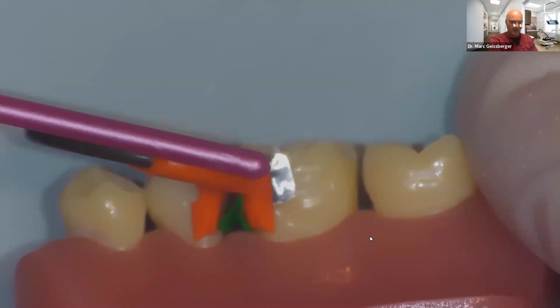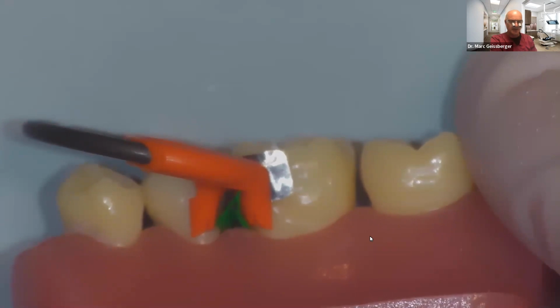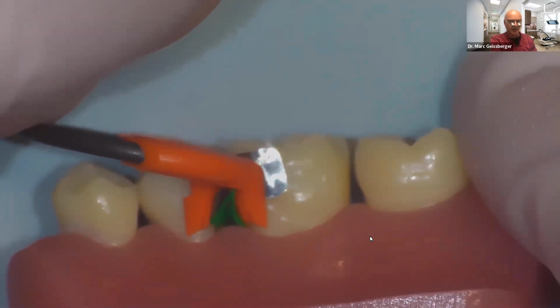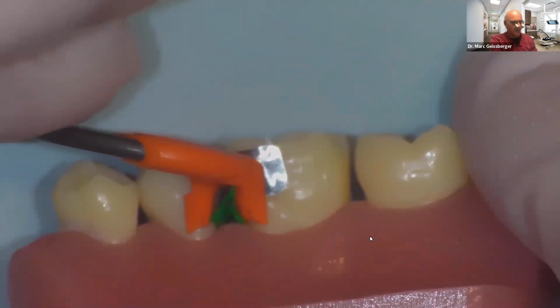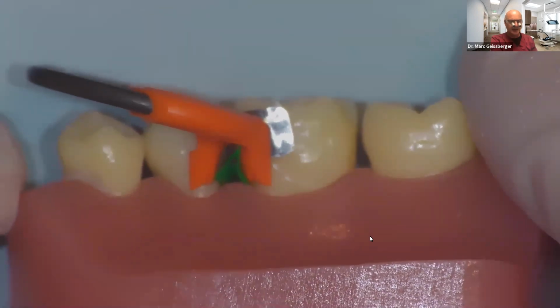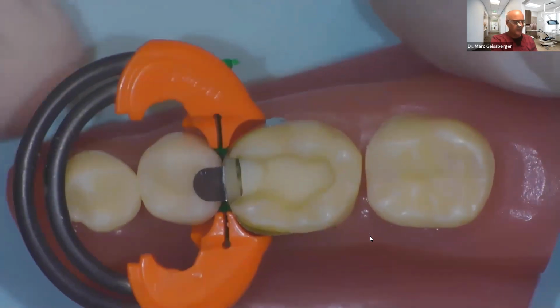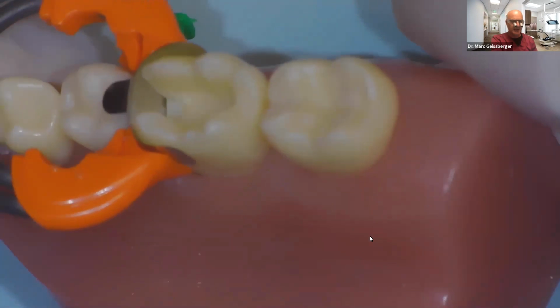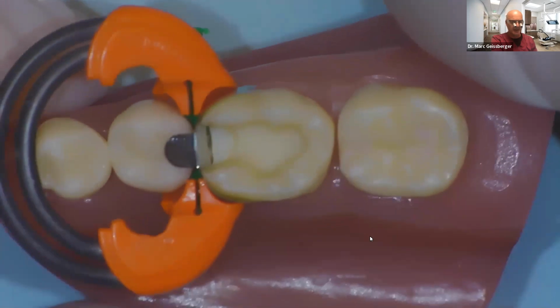Now you ask, why would that be set at 20 degrees? Well, the reason being is this was designed to be able to fit over rubber dam clamps. So let's just say you're working on a DO on number 30 and you've got a clamp on 31 and you want to put in a sectional matrix system, but the clamp's in the way. Well, this angle will prevent that clamp from interfering with your setup. So it works extremely well. And again, I want to roll this to the side so you can see that we're sealed there. What you're seeing is a little shadow from the camera, but we're perfectly sealed gingivally.